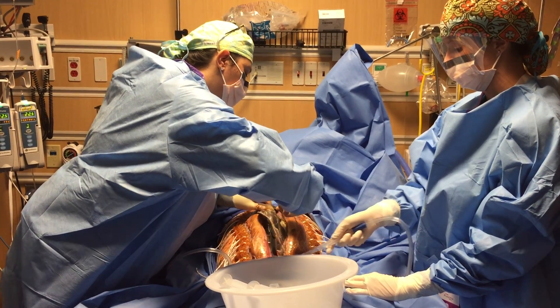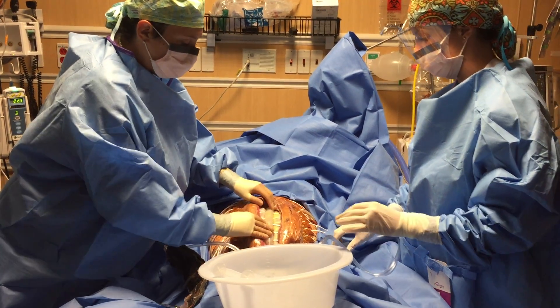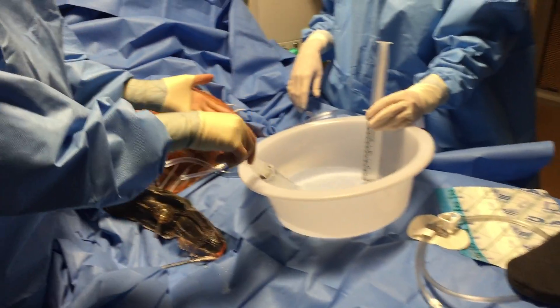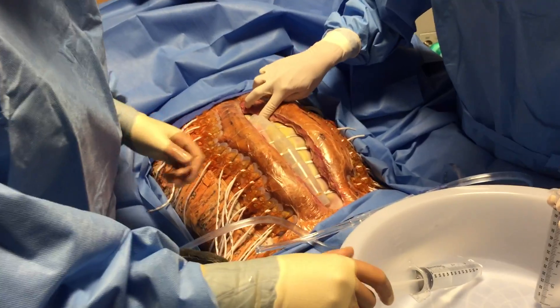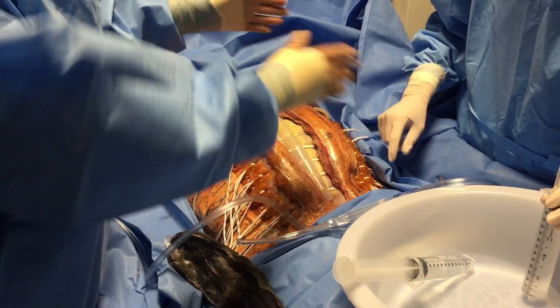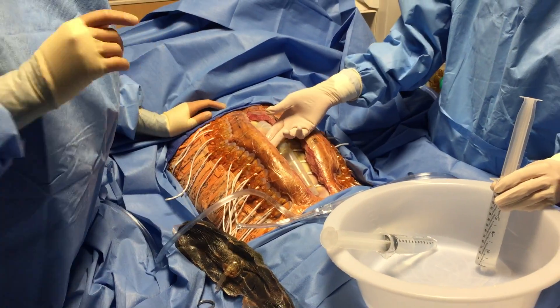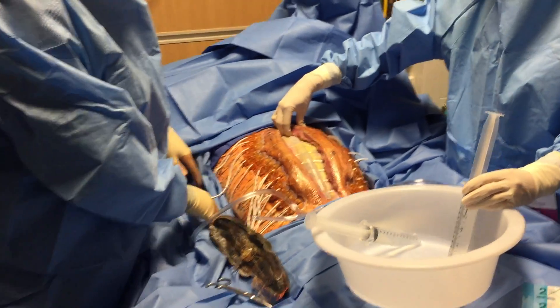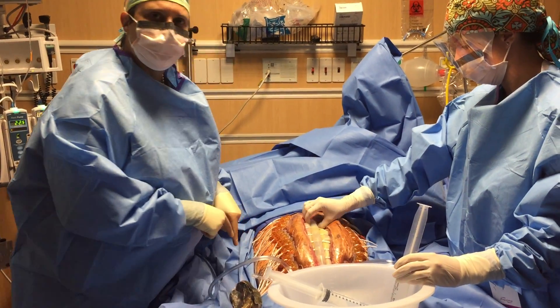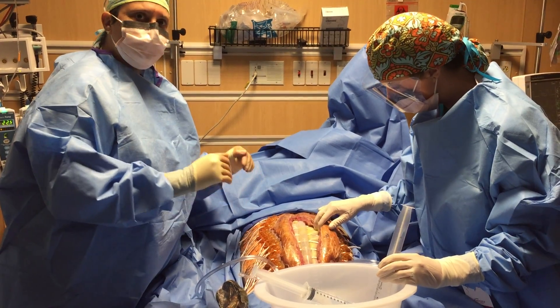You can just continue to replace this over the top. It gets a little thick, but it's not hurting anything. This is just exudate. Things you need for this: you don't need a whole lot — a new wound vac, a basin, a sterile basin with some saline, large syringes, sterile suction tubing, a Yankauer, and a pair of scissors. I do recommend a four-quadrant towel surgical drape and four three-quarter surgical sheets. I don't recommend a laparotomy drape, because the sheets actually cover better with no gaps. Laparotomy drapes tend to leave a gap and you can see straight down to the bed — that contaminates this. Don't forget, we're in the ICU, not the operating room.